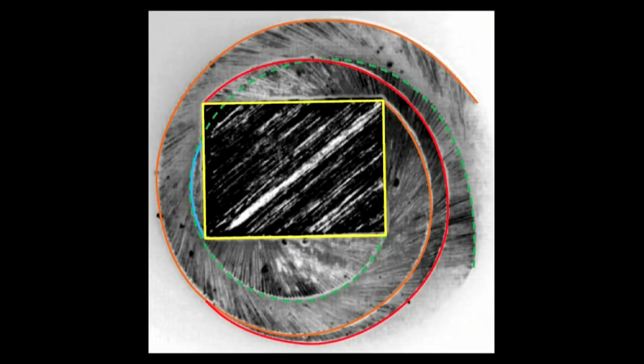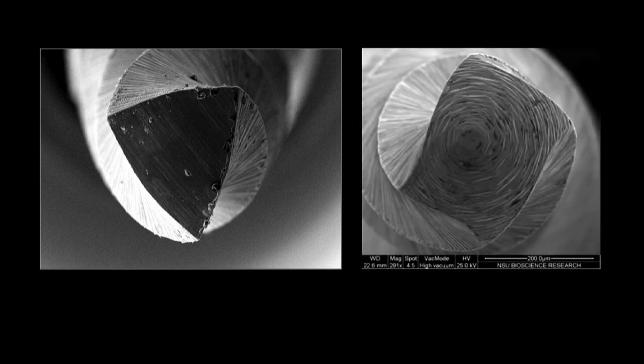If you can, this is a SEM, and it's colored so you can see it. You're looking down the ProTaper Next file, and you're looking at the rectangle as it would exist in that cross section. And when you look at the instrument from the side, it looks different. It looks wavy. It looks serpentine. And when you look at the cross section compared to ProTaper, that's the original ProTaper cross section, you can see clearly that this is a rectangle.